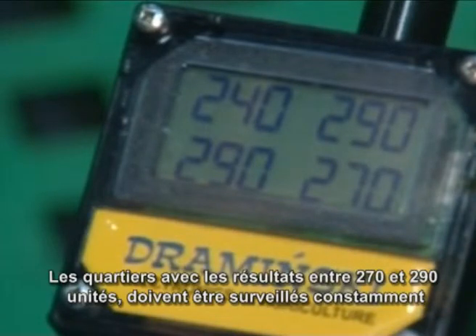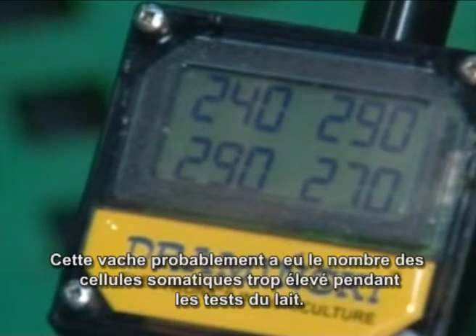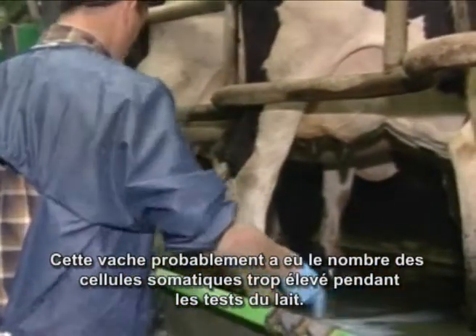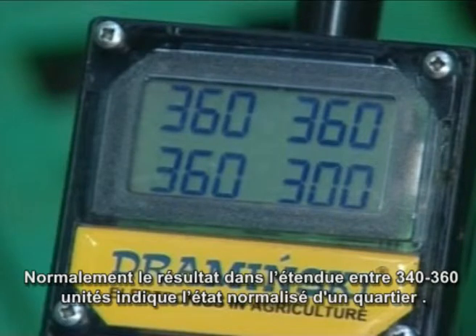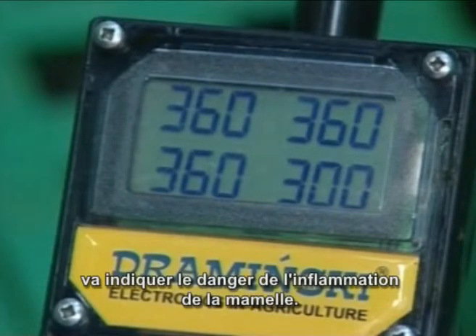Quarters reading from 270 to 290 may need regular monitoring to check that figures do not change — this cow is probably contributing to high somatic cell counts in your bulk tank. Most commonly, readouts are placed in the range 330 to 360, and the incidence of subclinical mastitis at this level is very low. For cows giving readings around 350, only a decrease below 300 is an indication of a mastitis threat.